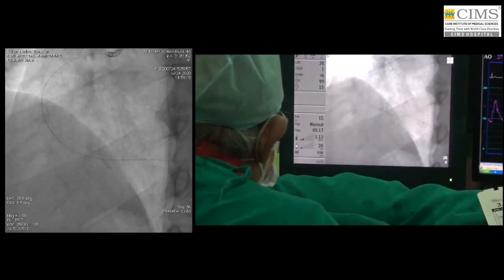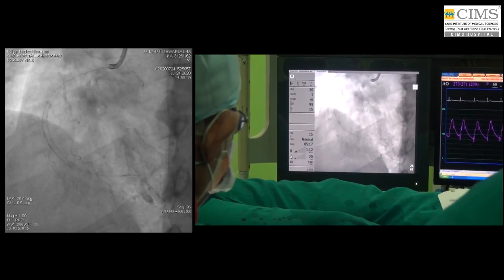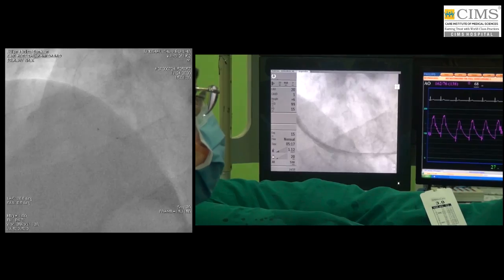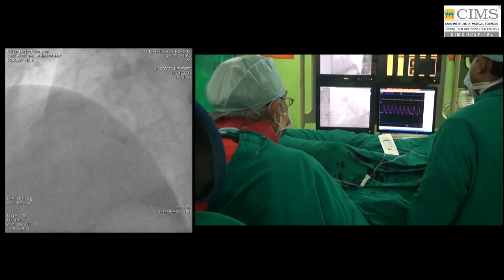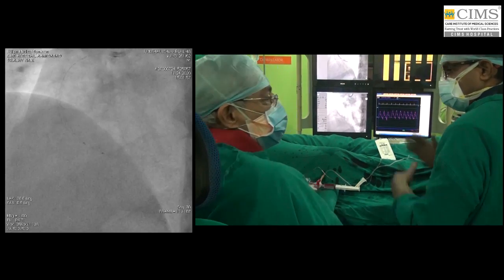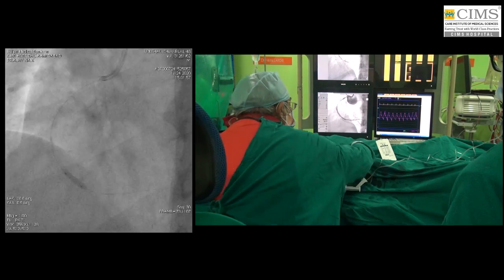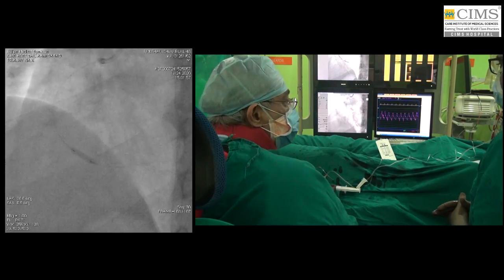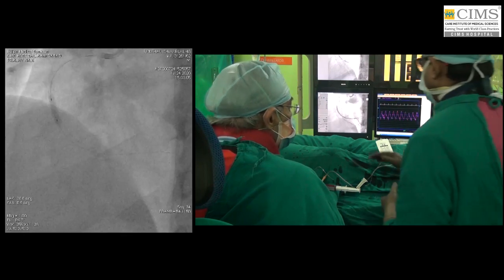Does it really help? Yeah, StentBoost technology really helps, but I use it very infrequently. Some of my colleagues use it all the time. It is basically a technology which gives much more radiation through the image intensifier, creating much better imaging of the stent. But the hazard is very high radiation dose. So I use it very infrequently, only in complex cases.